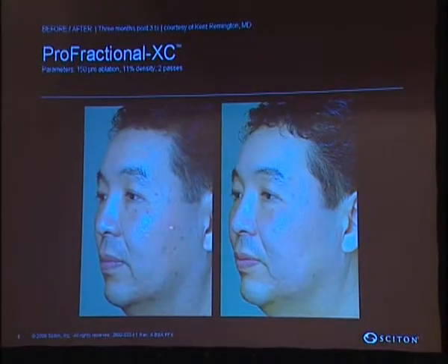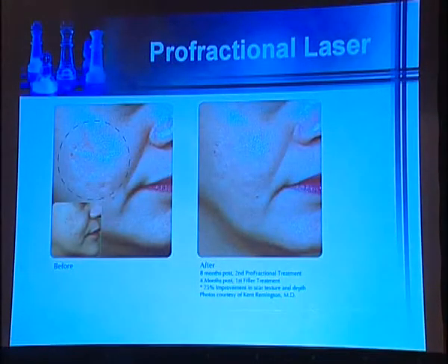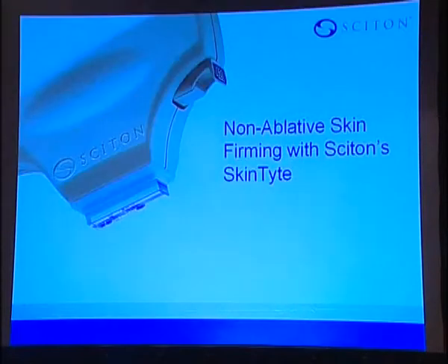Also here, this is in a slightly dark skin, and you can see the improvement and the rejuvenation effect. This is acne scars. Also, this is 8 months after 2 treatments. This is the same case which we showed before.